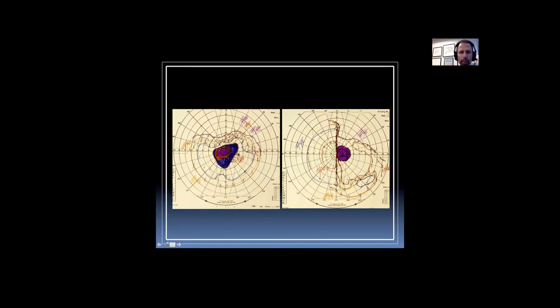So basically, if you just look at this, that means all the rest of the field is gone to this smallest stimulus. So there's a big central scotoma. You can tell that from the other isopters. When you look at the other side, if you look at just the smallest isopter, what do you see? You see this with exquisite respect to the vertical midline. So this is the right eye. So this person's lost all of their temporal field.